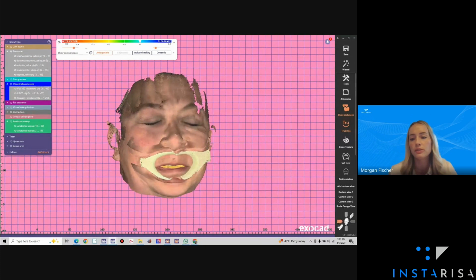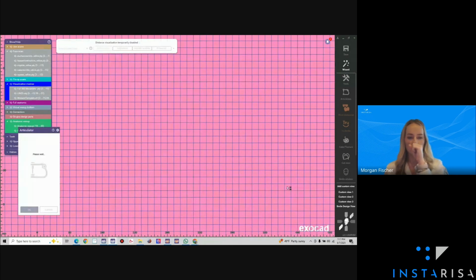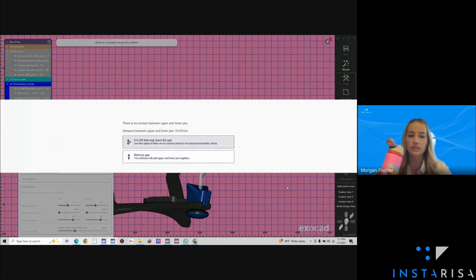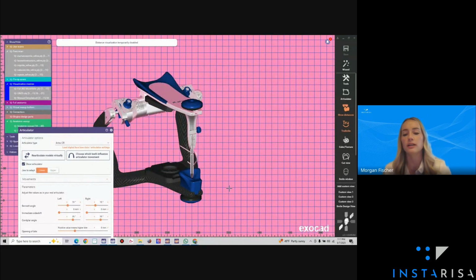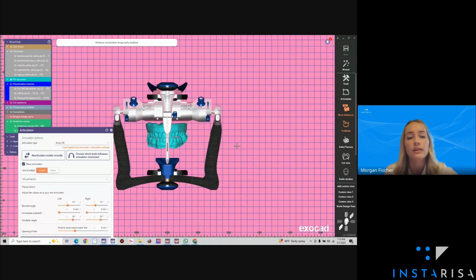So before we start here, I always just like to check my alignment on the articulator. I won't get too much into the weeds of exocad here. Overall, I'm just trying to show you guys how I get to the finished product. So like I said, everything will be aligned within the articulator here. Another great part about using facial scans is that I'm a lot more confident when I am using my virtual articulator versus if I don't have facial scans and I'm just working off of the IOS scans and the 2D photos, or no 2D photos.